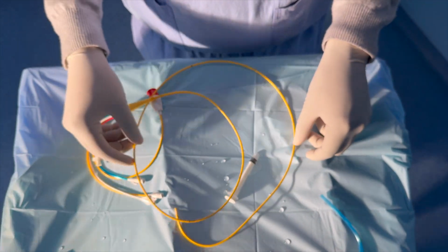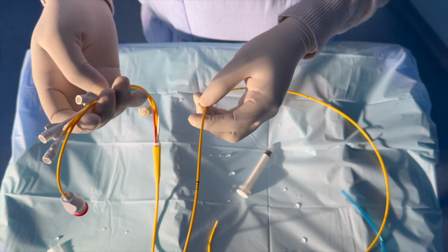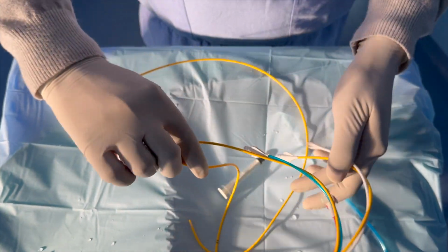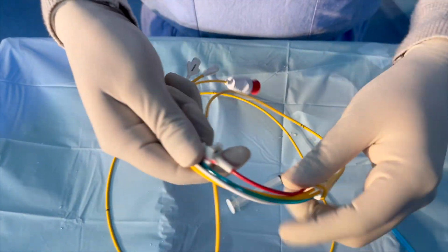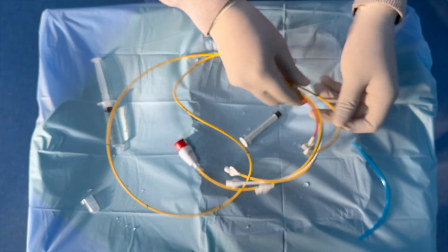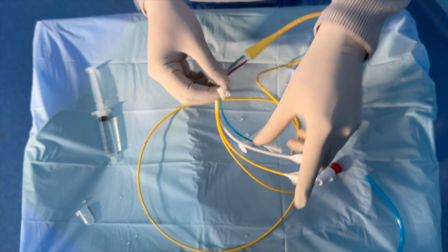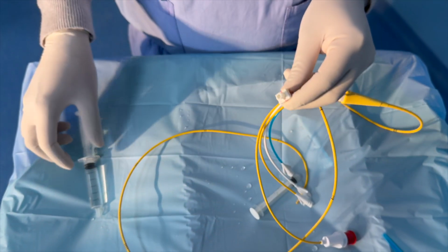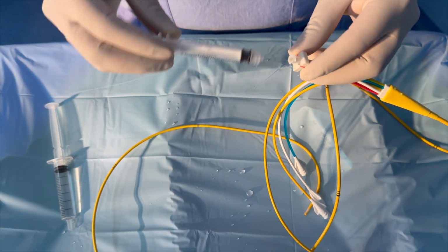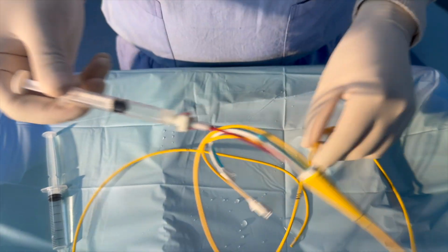The PA catheter has many lumens, so I will explain one by one, and we will check the patency of all these ports. Now this first red color small port is the balloon inflation port. First we attach the 1.5 ml Luer lock syringe.